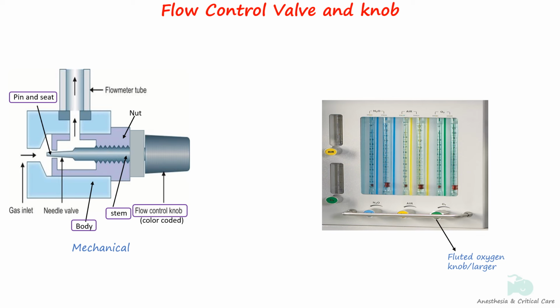These knobs are sometimes protected behind a shield to minimize accidental change in position. They are also placed high above the working surface to lessen the likelihood of contact with objects on that surface. The flow control knobs are turned counterclockwise to open the gas flow in the flow meter and clockwise to close the gas flow.